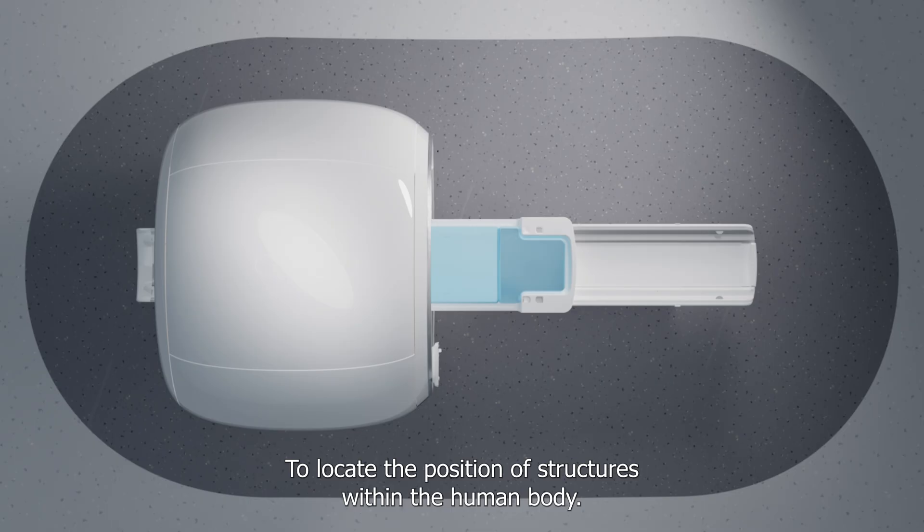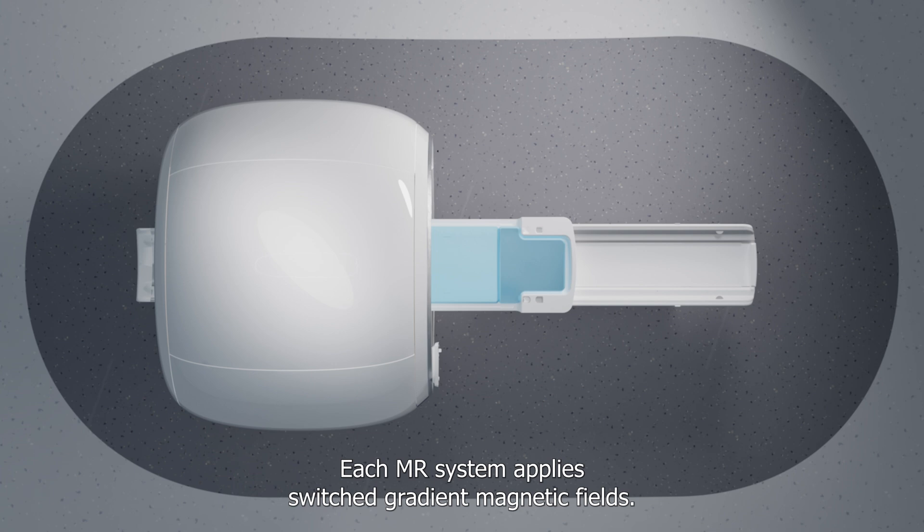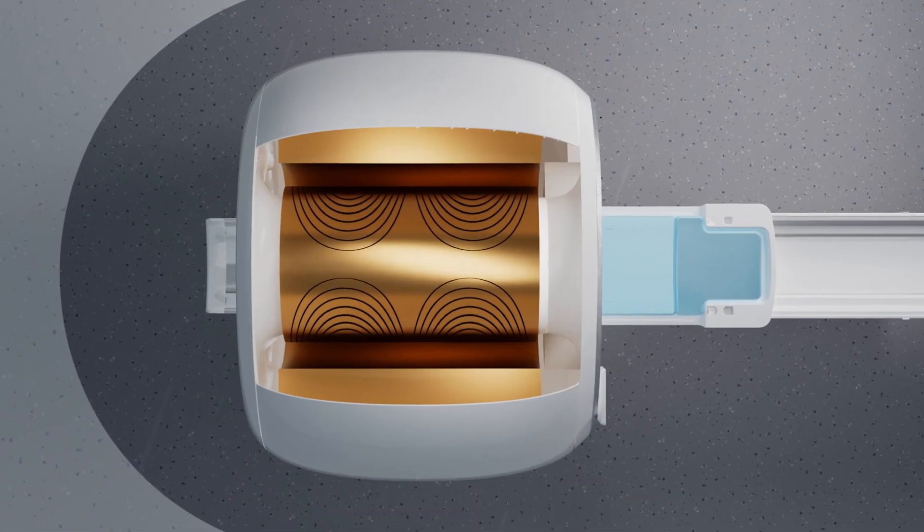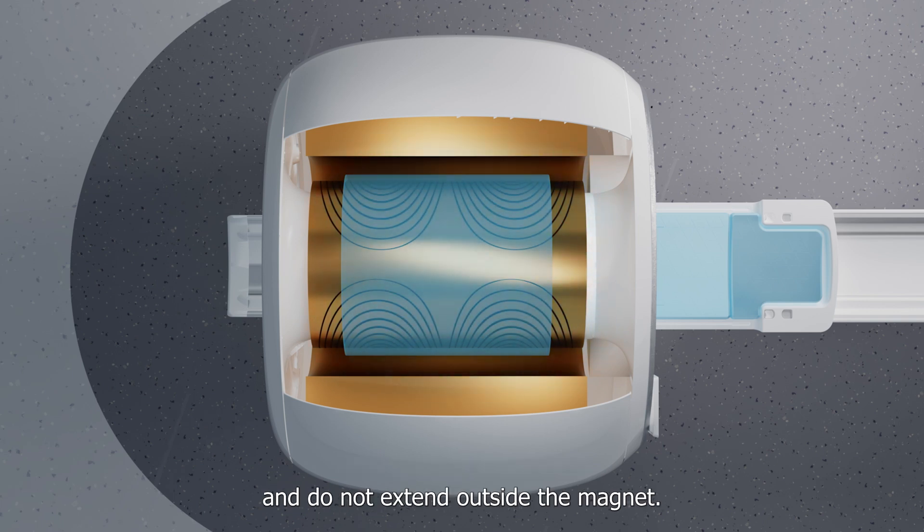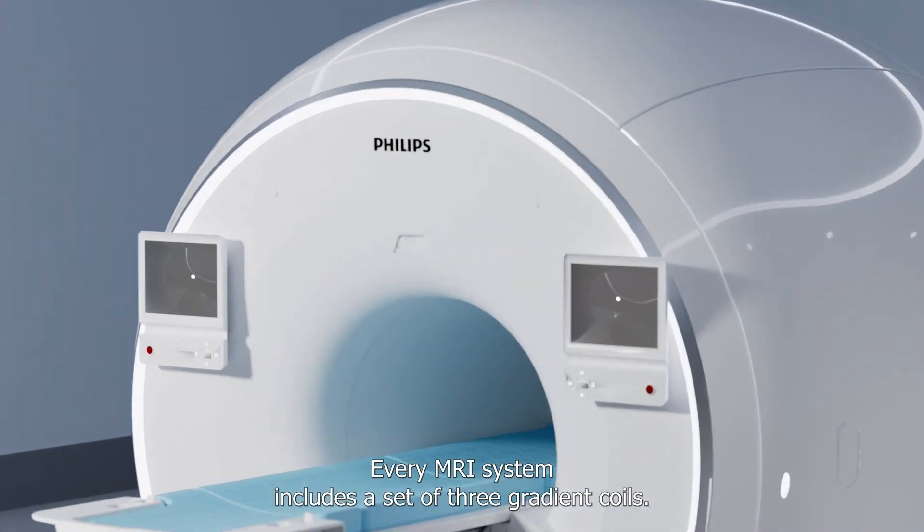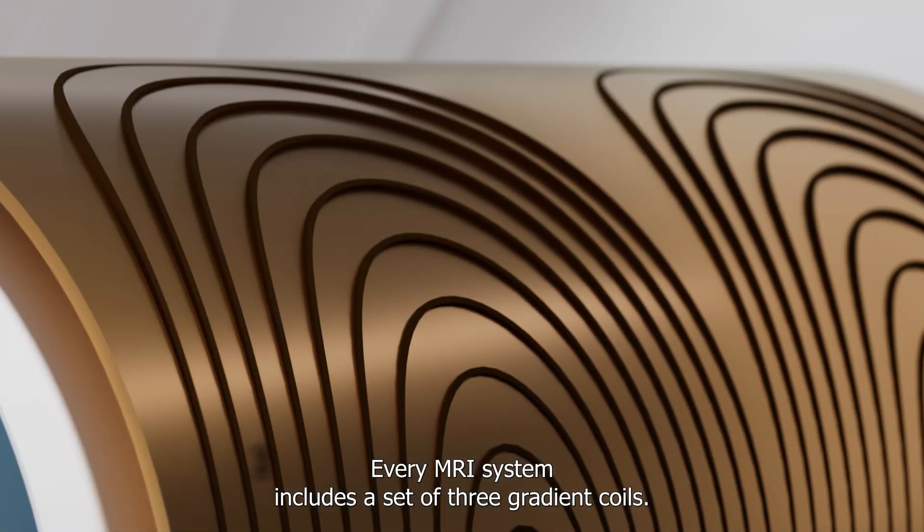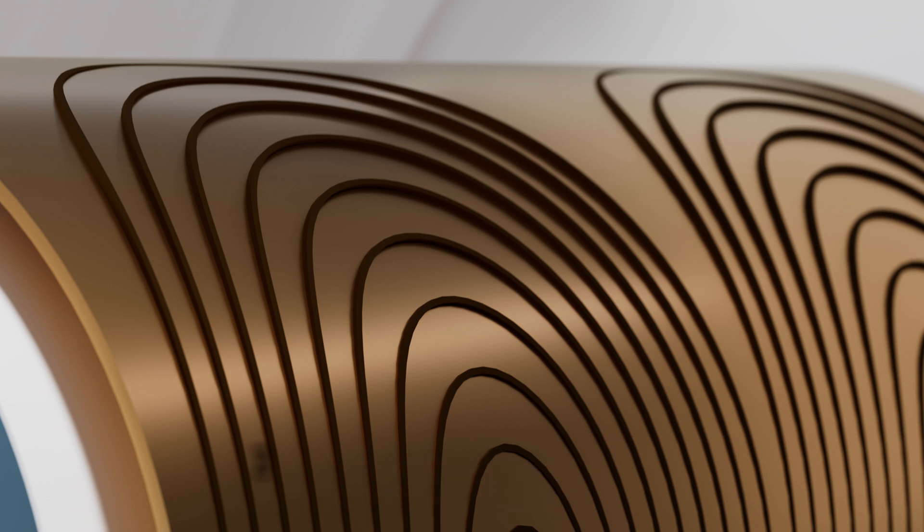To locate the position of structures within the human body, each MR system applies switched gradient magnetic fields. These switching gradient fields are only active during scanning and do not extend outside the magnet. Every MRI system includes a set of three gradient coils. These gradient coils create the gradient magnetic fields used for the spatial encoding of the MR signal.